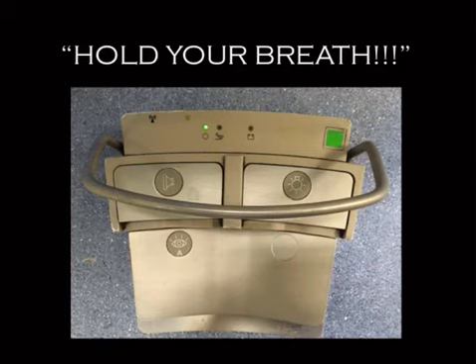And it's also the reason why you will typically see a little bit of bowel gas on a DSA run, because the bowels, you can't tell them to hold their peristalsis. So you probably have a pedal that looks like this in your angio suite. Most of them look the same. This one here is usually for the overhead light. This is typically to tap the fluoro button. And then you've got something like this that you tap on when you want to do your DSA runs, where you step on it and hold it.